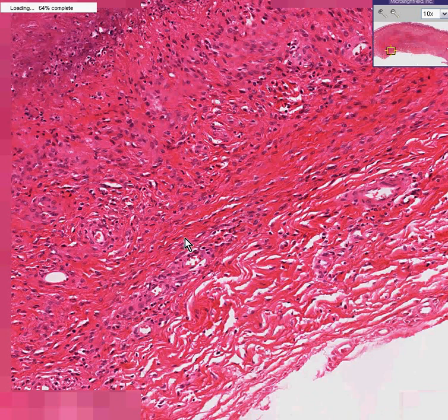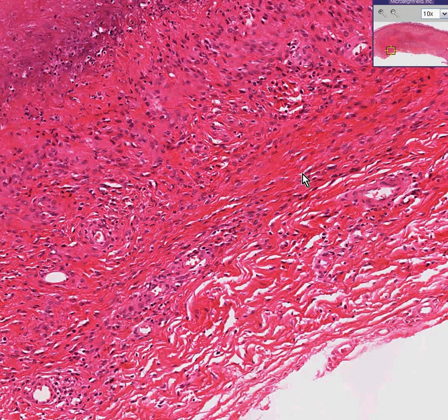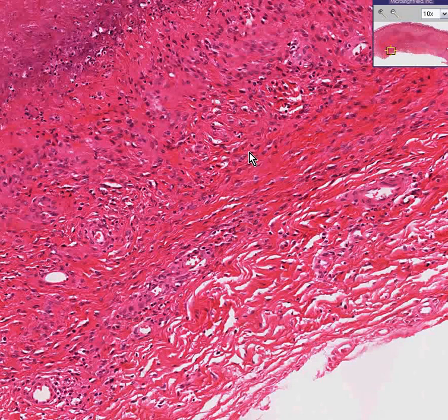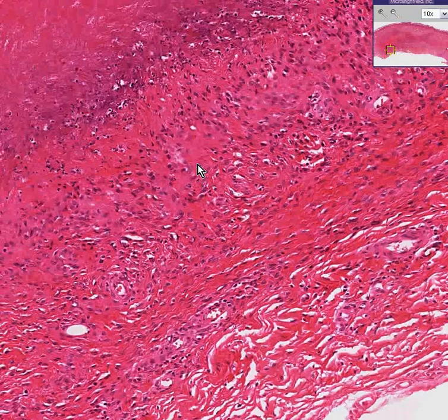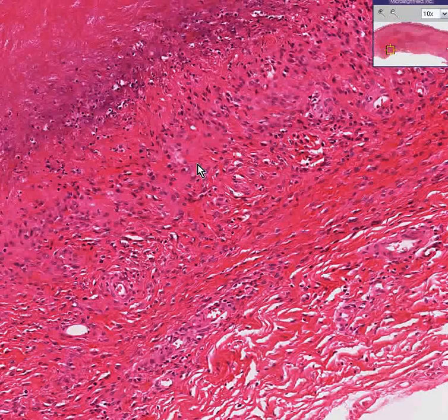There usually are not the classical types of epithelioid or multinucleated giant cells that you would see in other types of granulomas. But I think most people would agree that a rheumatoid nodule is a type of granuloma. And thank you very much.